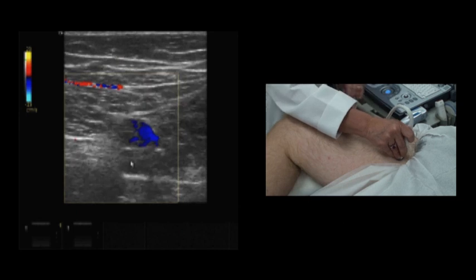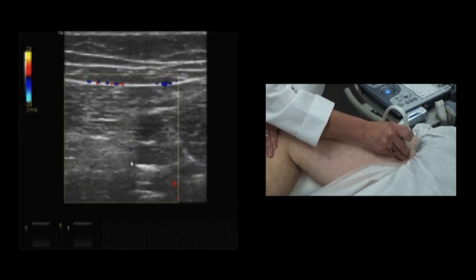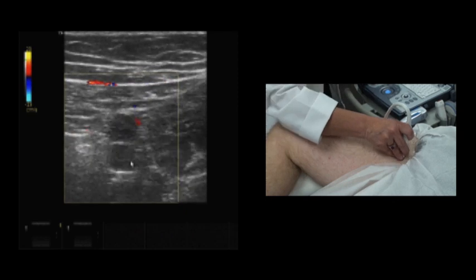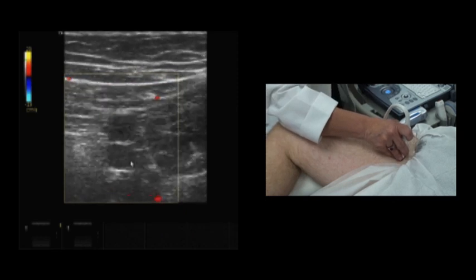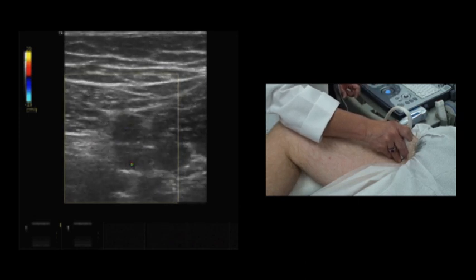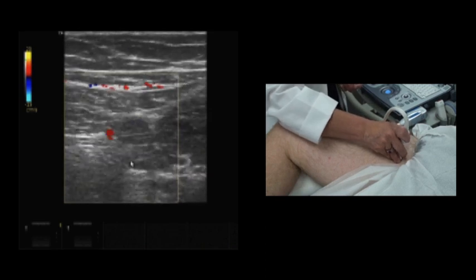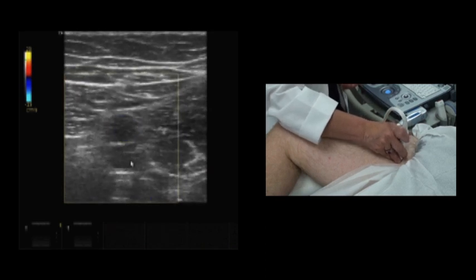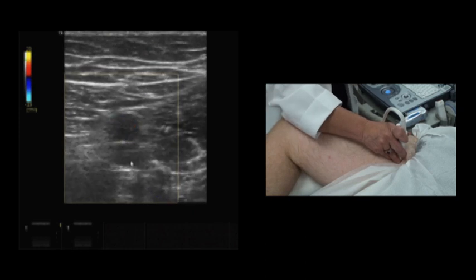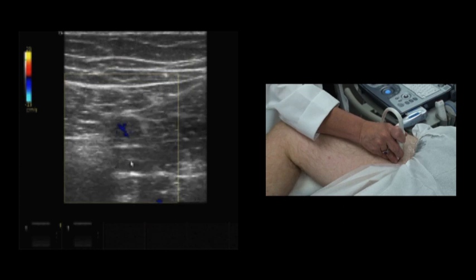And again, we're just left with that superficial femoral vein. And with a little augmentation, we see the color filling. We want to make sure that the color fills the vessel completely, because we want to make sure that we do not have thrombus, anything that's within that lumen. Color is a very beneficial tool to be able to see if the complete lumen is being filled. And now we'll move to the popliteal.